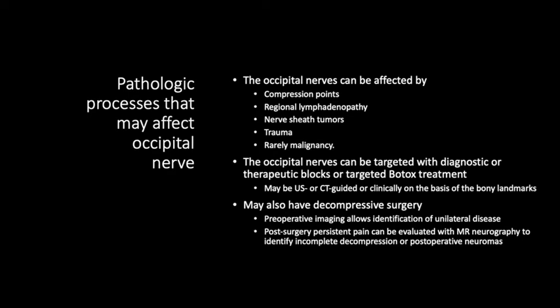So they want us to be able to say that there is pathology on one side and not pathology on the other. Additionally, if they continue to have pain post-surgery, we may be able to identify some sort of injury such as a neuroma.